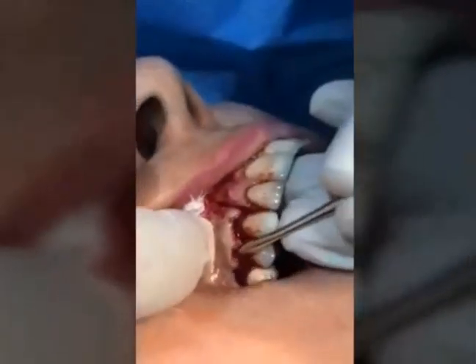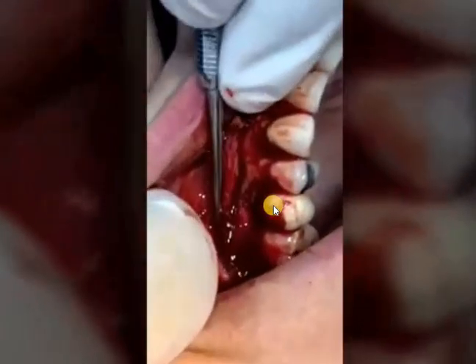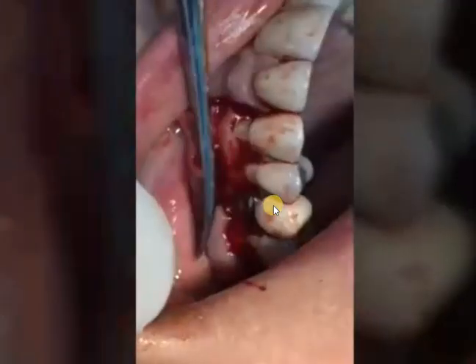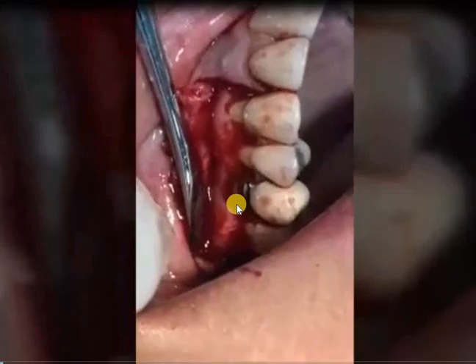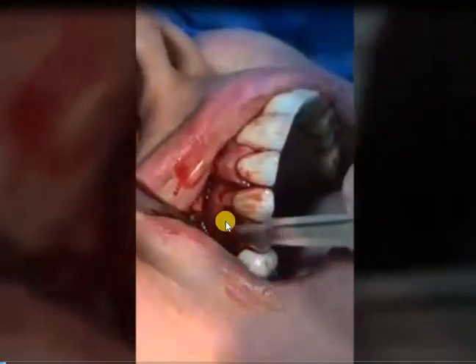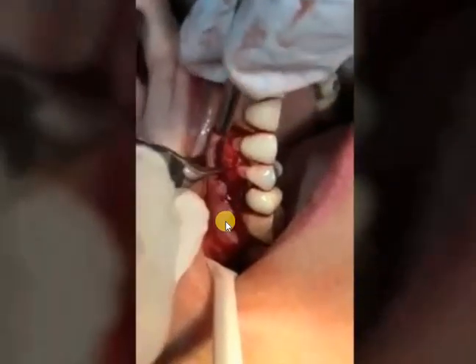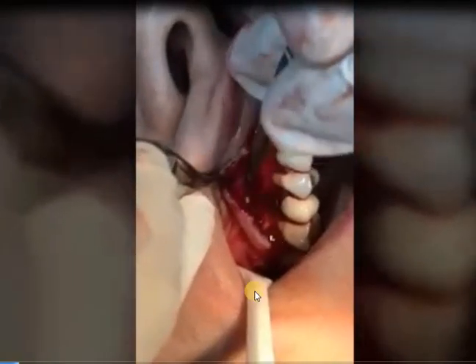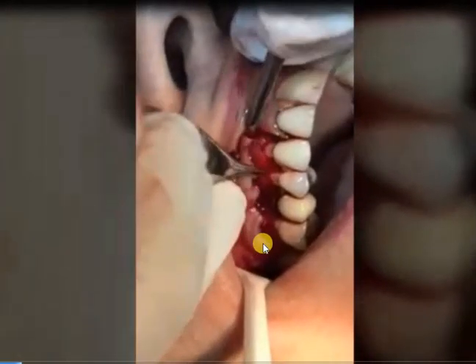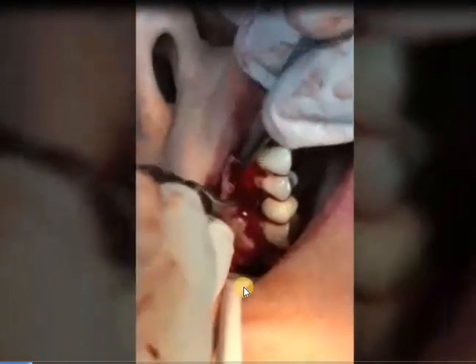We are reflecting the flap. The flap should be reflected using two techniques. This is the area of the defect as you can see it now. First, a full thickness flap for four to five millimeters, then a partial thickness flap — as you see here — to release the muscles and create space for the bone graft and PRF.